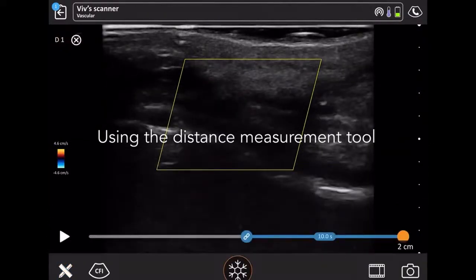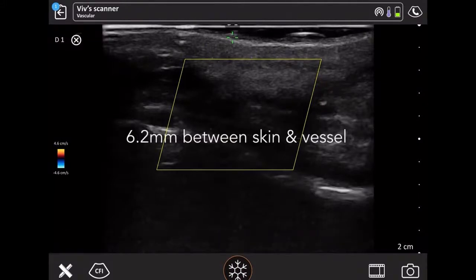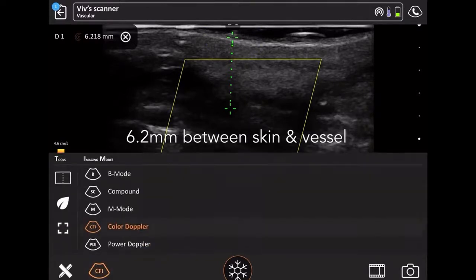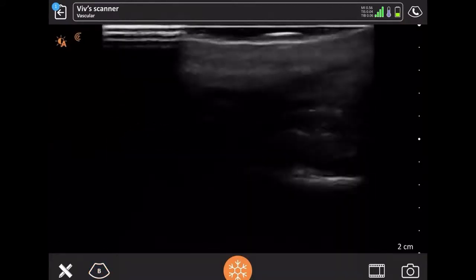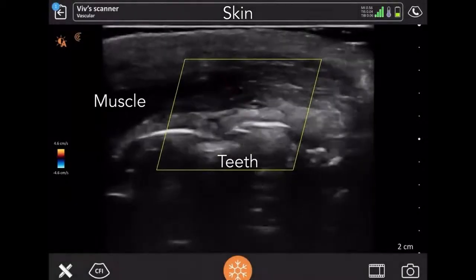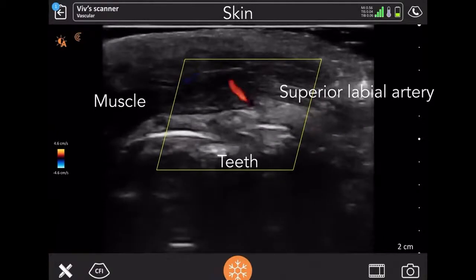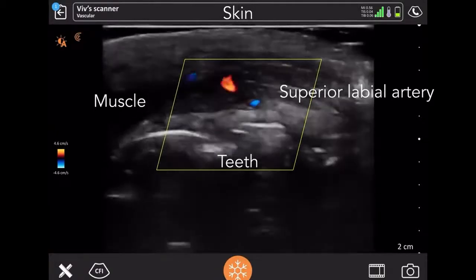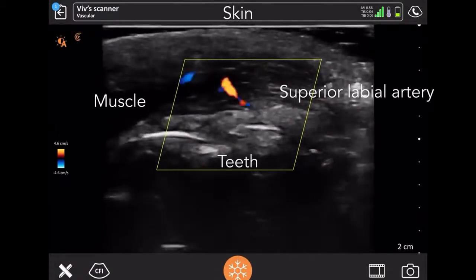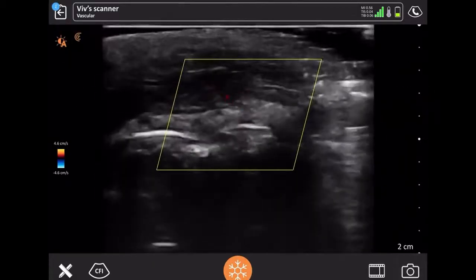So here I'm looking at the distance between the skin right at the top and the position of the vessel, which in my case was about 6.2 millimeters. There is one more distance measurement I recorded, which was back to the lip area, and I looked at the distance between the skin of the lip and the area of the artery lower down, and again there's not a huge amount of space to play with. We're talking about just a number of millimeters.